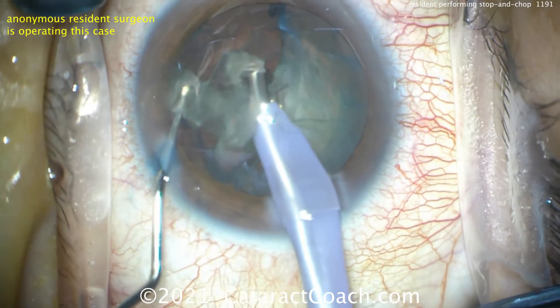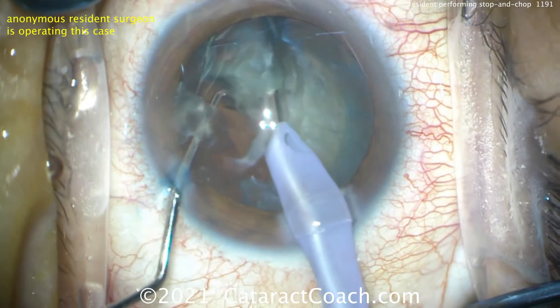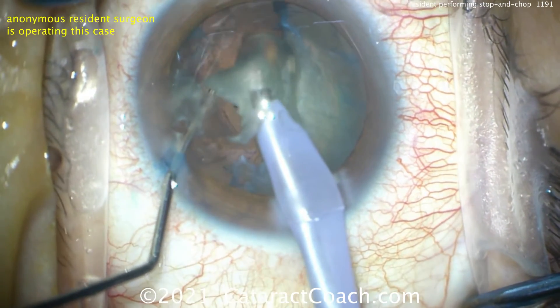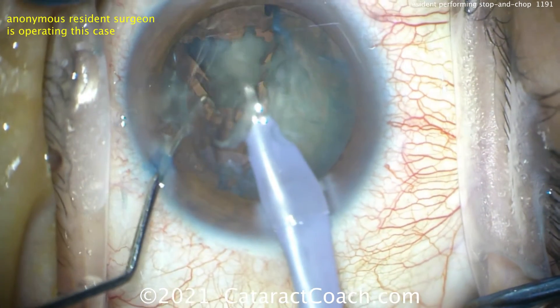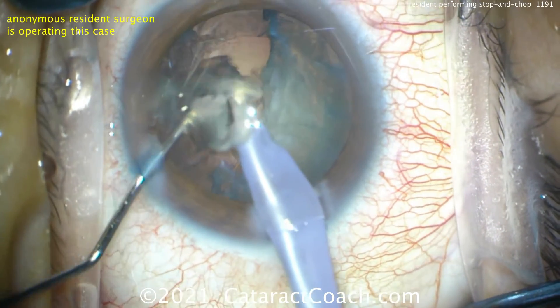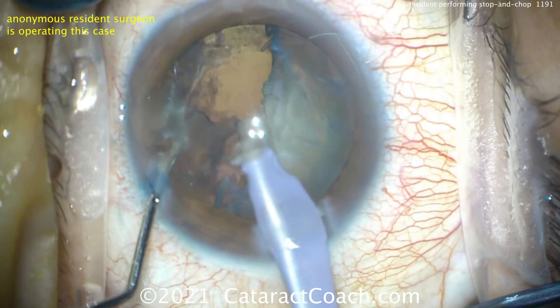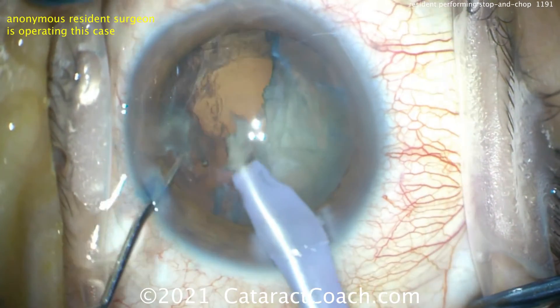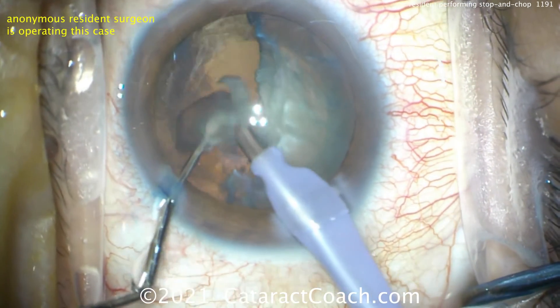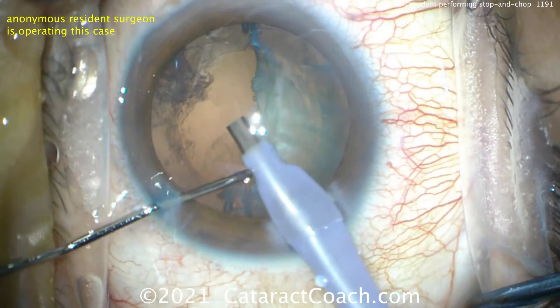Be a little cautious — look at the phaco sleeve and the phaco needle. It's a little close to that incision, so pivot the hand. The needle should be in the middle of your incision so it gets cooled on either side. If you push up against the side of your incision, you can have direct heat from that phaco needle — the friction can burn the cornea. You can also minimize risk by using a good duty cycle on pulse mode, a lower duty cycle less than 50%. Staying in the center of the incision is certainly the key thing.